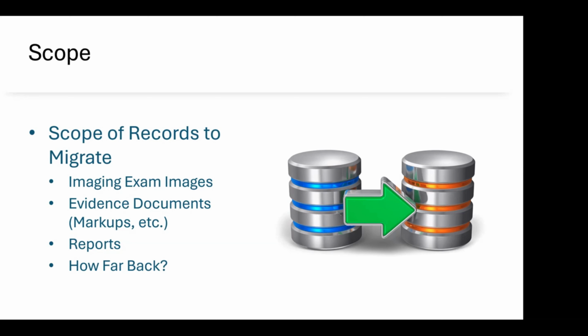Now, faced with the data migration process, a lot of organizations ask the question: do we need to migrate all of this data? This 18, 20-year-old ankle X-ray, how important is that to bring along? With a lot of orgs, they have 25 plus years of data, and the value of priors for comparison is limited. And the reports for those exams are often not imported into the EMR, so someone deemed the results not important enough to keep.